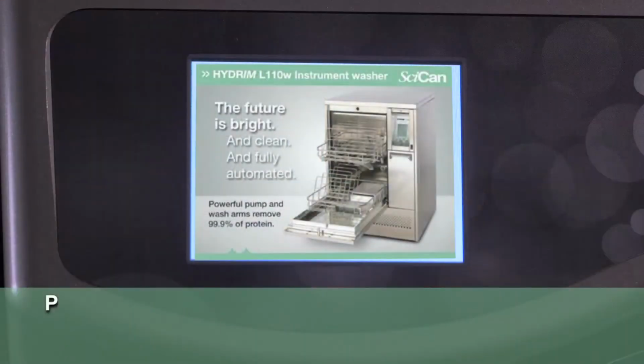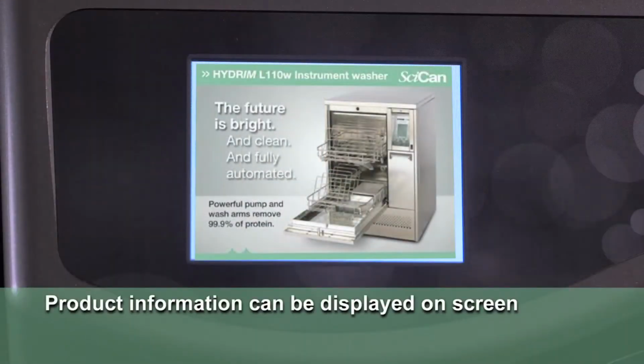Finally, if the unit is installed and set up properly with your company's ID, the new G4 LCD will display custom product information directly from your head office. Be on the cutting edge of innovation and communication. Ensure the unit maximizes on its full potential by connecting to the office network and internet.